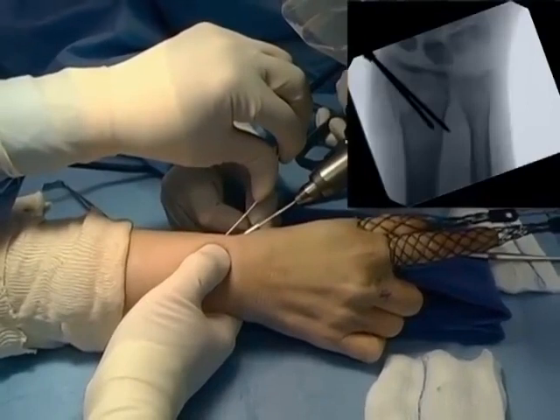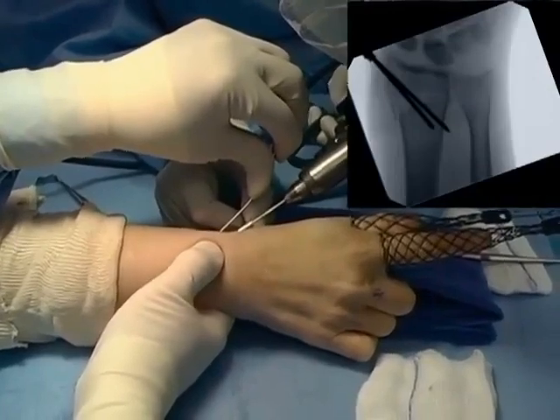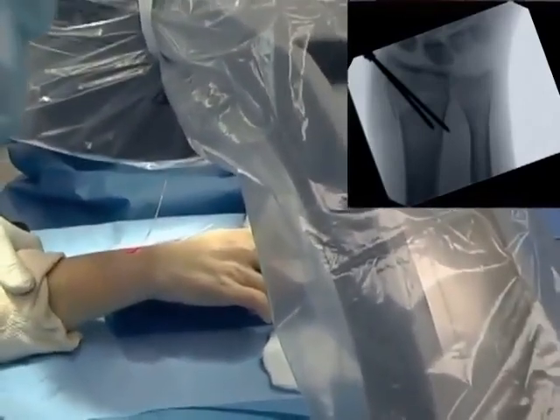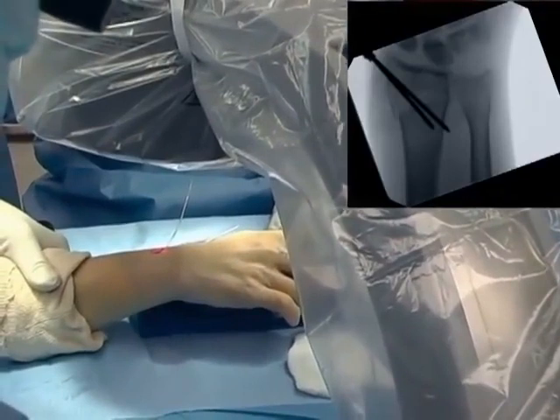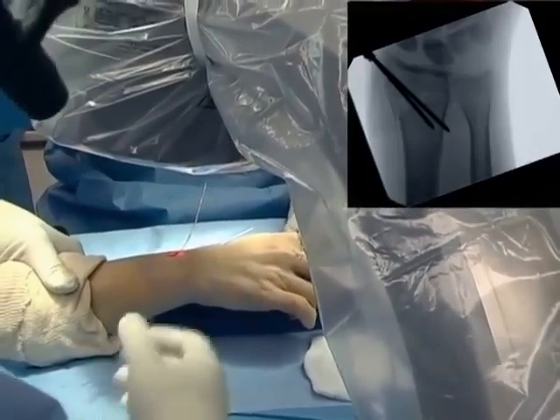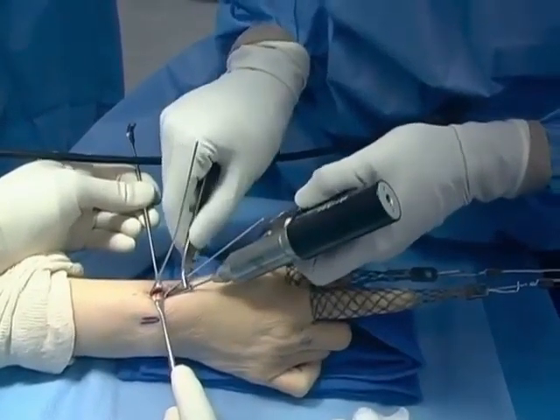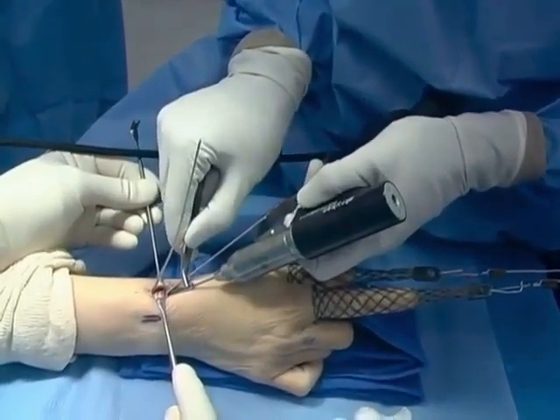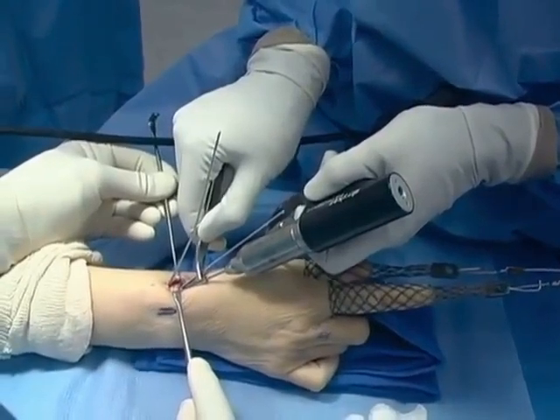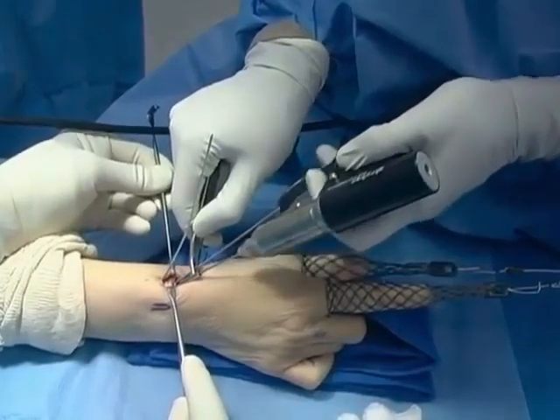In the coronal plane, position and fracture reduction are confirmed with the image intensifier. A second pin is driven into the opposite cortex to stabilize the fixation.